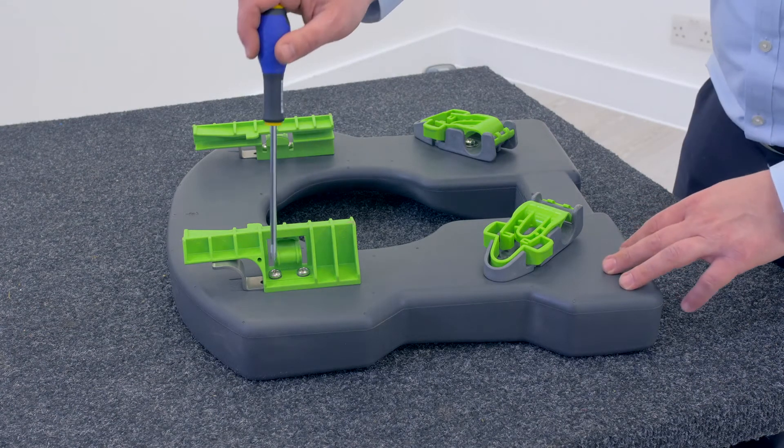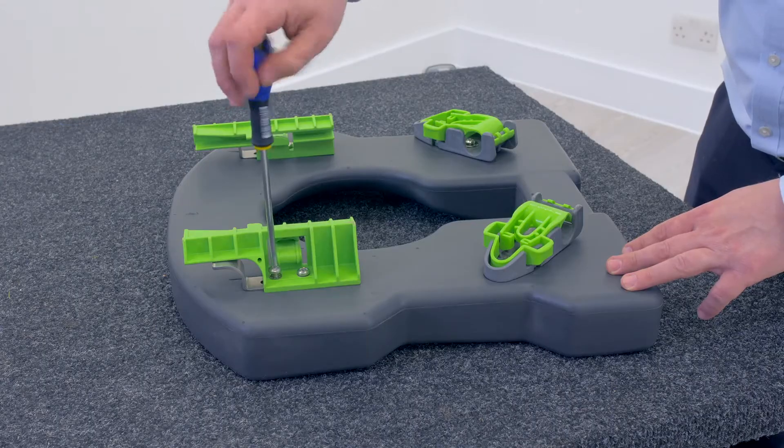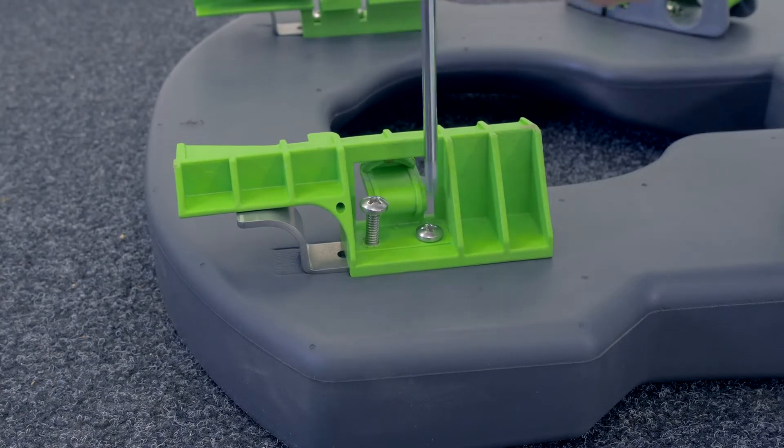Remove the seat from the chair and place upside down on the table. Using a Philips 2 screwdriver, simply undo the two screws and remove the green plastic clip.